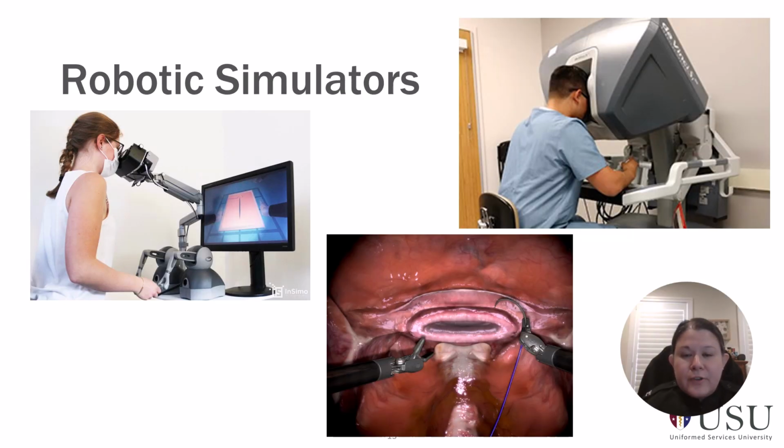Robotic simulators are very popular as well, and I think particularly helpful for people that are learning to do robotic different procedures in obstetrics and gynecology. There's a couple examples here. You can really get a lot of benefit out of learning how to be on the console, how to dock the console, and how to complete procedures on the robot.